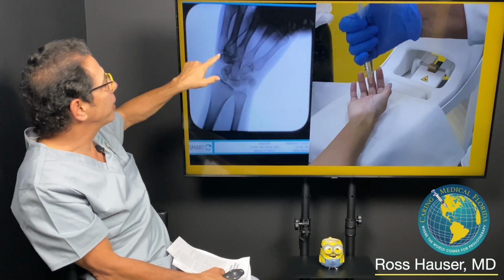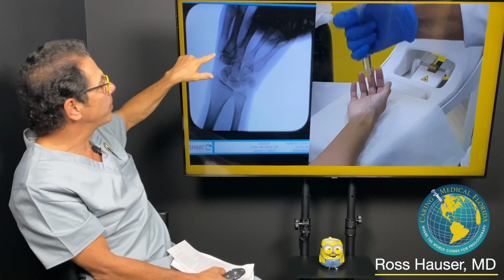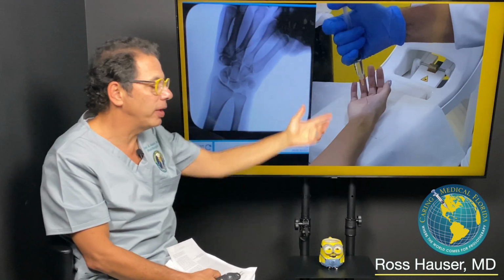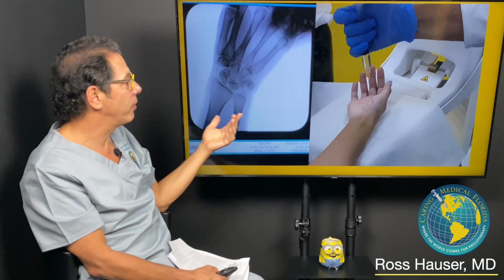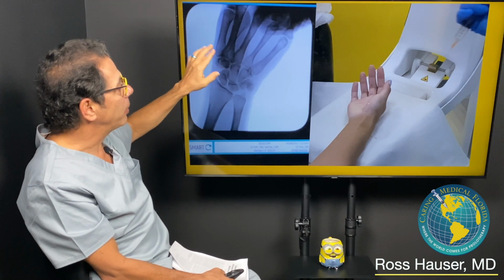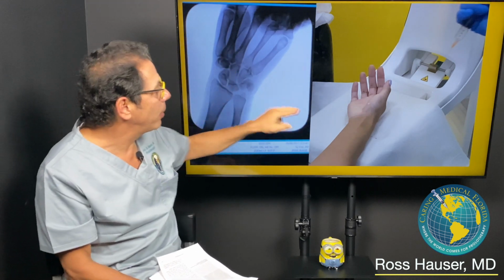Then this is interesting because you're going to see it's under x-ray. I just did this for educational purposes. See the needle going in? So we just did this. This was a training video that I made for some physicians. And I just wanted to show where the needle was. And you could see where the needle was going down to the bone here, the basal joint.